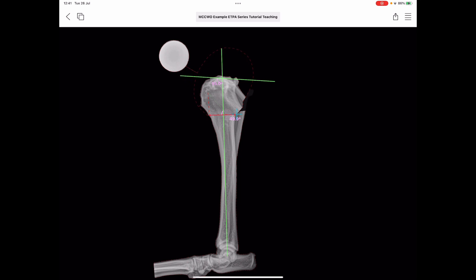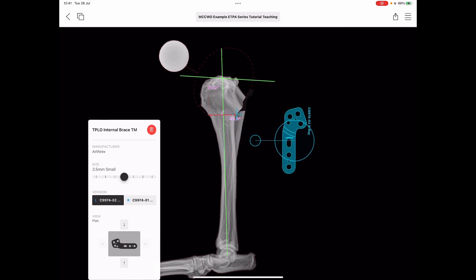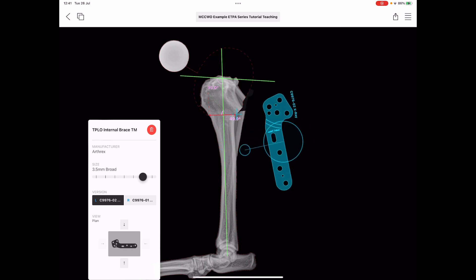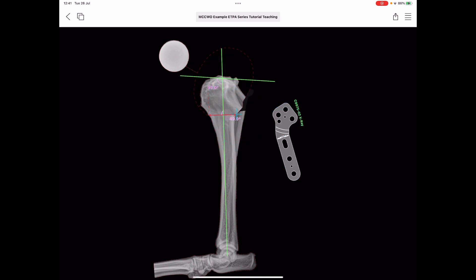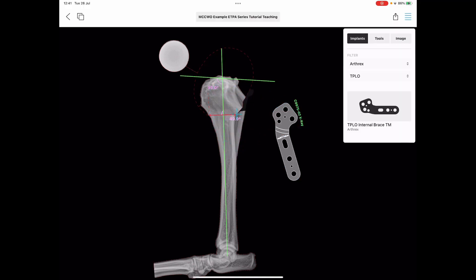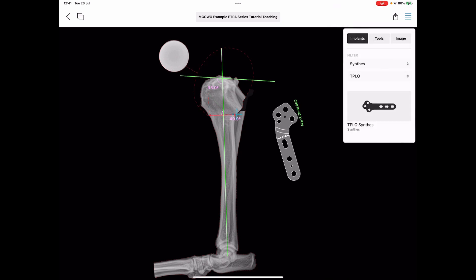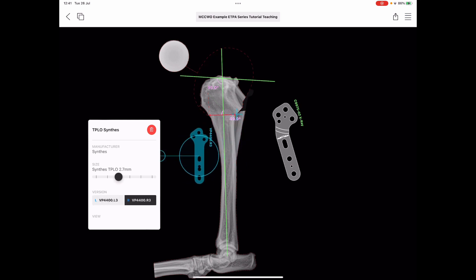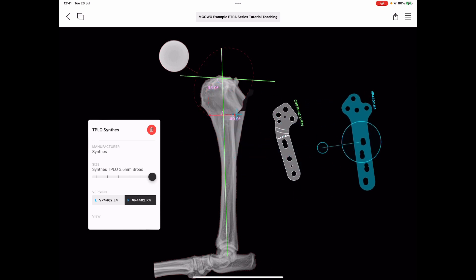We define the proximal bone stock, then reposition for optimal cortical alignment — lining up for cortical apposition. We tap the axis, then tap the angle, and we can see that yes, we've achieved our target. The last thing to do is the template: Menu > top right > Implants. Choose a plate manufacturer of your choice. We can explore manufacturers — for example, Synthes, where we have less chordal overhang — and choose the appropriate orientation and size. For this particular tibial morphology, a Synthes plate might fit well.